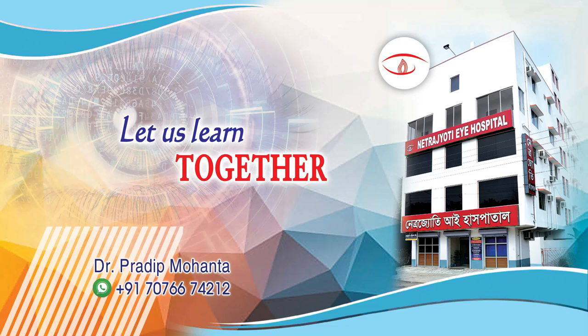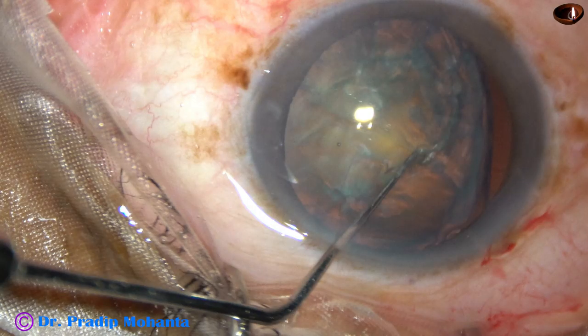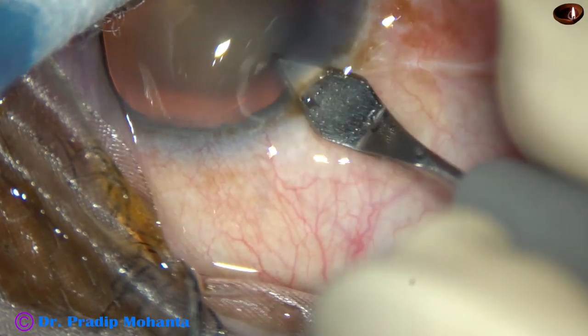Friends, welcome to my workplace at Ranak Hutt, West Bengal, India. This is a subluxated cataract. The subluxation is from 8 o'clock to 11 o'clock, spanning 3 clock hours.